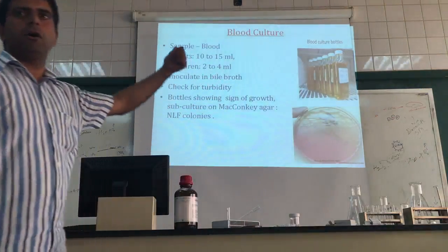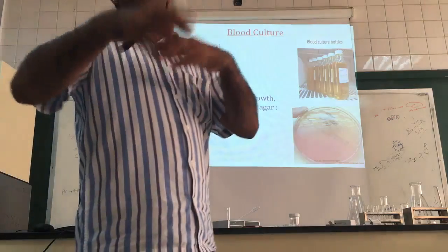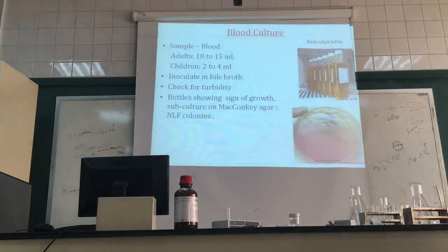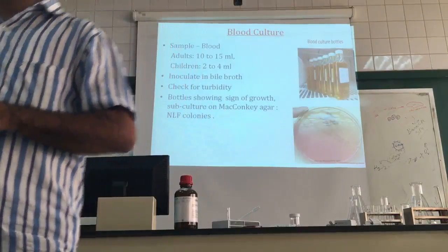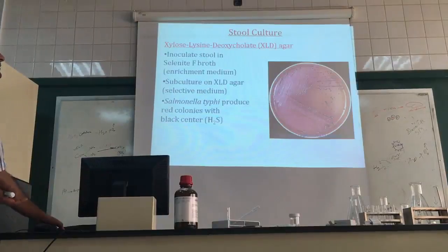So, doctor, you put it in the broth, and if there is turbidity, it means there is growth. Turbidity means there is growth. Okay? Then you check for McConkey agar. Then we go for the McConkey. If it is a non-lactose fermenter, confirm this is Salmonella. And another test I told you, catalase, already shown.